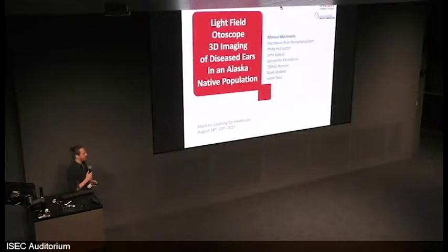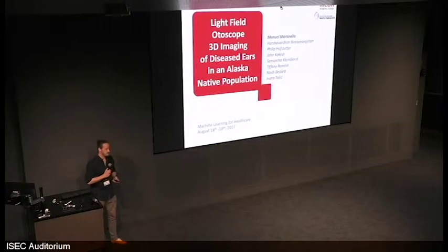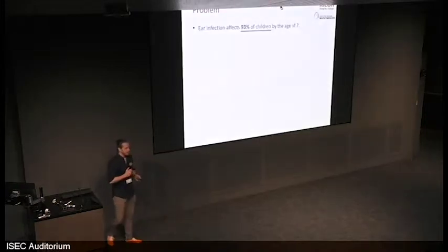Hello, my name is Manuel, and together with my colleagues from RICO, Northern Sound Health Corporation, and Alaska Native Medical Center, I'm here to present a study on 3D imaging of ear infection in the Alaska Native population. Now, ear infection affects 93% of children by the age of 7.